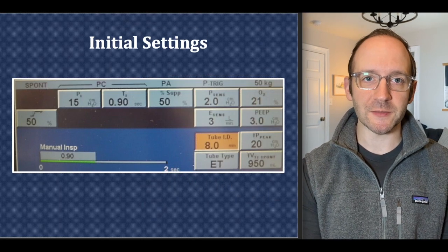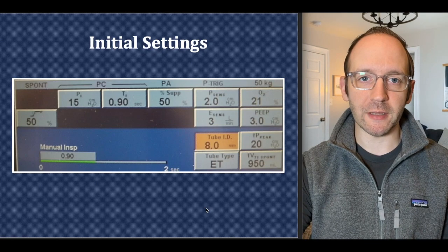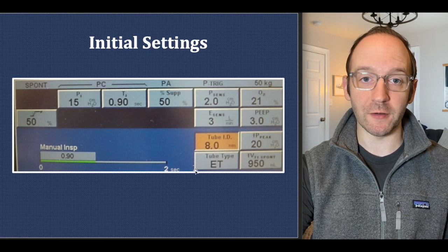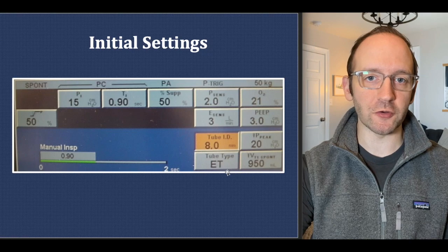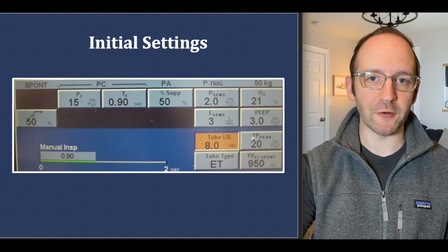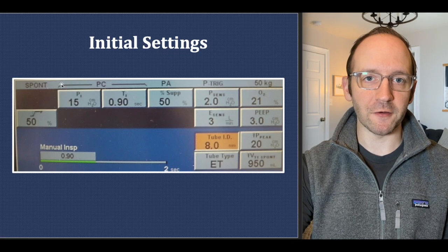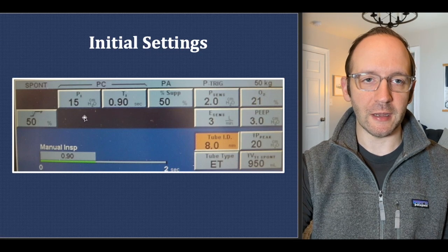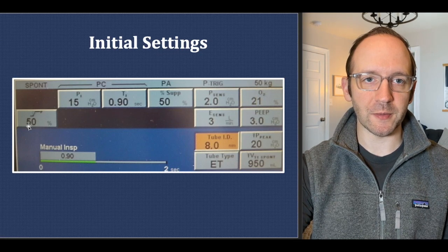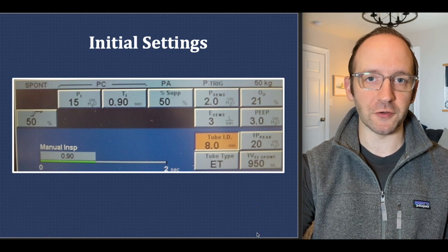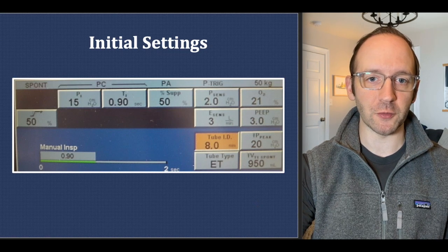Here's what initial settings might look like in PAV. Because we're calculating resistance, it's helpful to know the ET tube size and whether it is an ET tube or a tracheostomy. There are safety parameters in terms of peak pressure and high tidal volume alarm, backup settings in case the patient becomes apneic, and sensitivity settings for both trigger and cycle of breath, in addition to your normal FiO2 and PEEP settings.